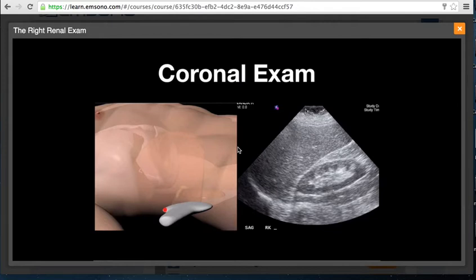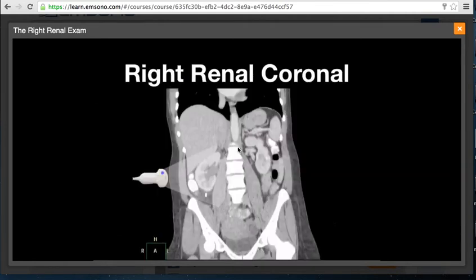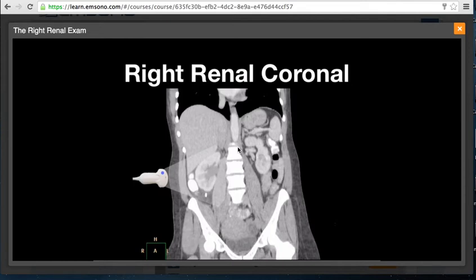Here we have the coronal image of the right kidney. With the transducer going from lateral to medial, you can see the liver, the perinephric fat, and the kidney itself with the parenchyma, the hypoechoic medullary pyramids, and the renal pelvis. Using a coronal CT scan through the right kidney to better understand the ultrasound image: the liver and right kidney are visualized, and the coronal scan is ideal for assessing the collecting system since you can visualize the minor calyces, major calyces, and pelvis all in one plane and confirm they connect with one another.